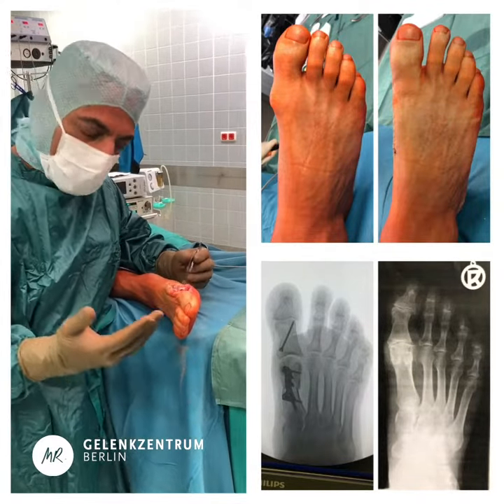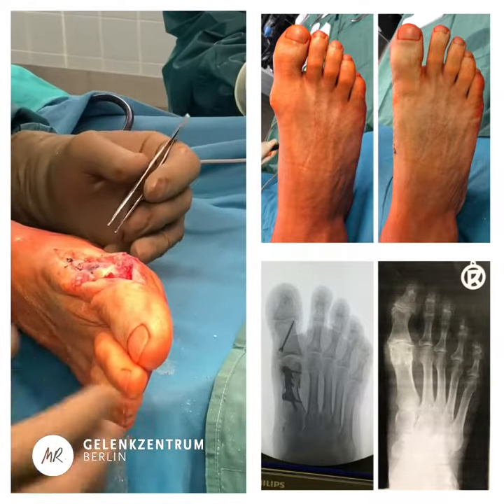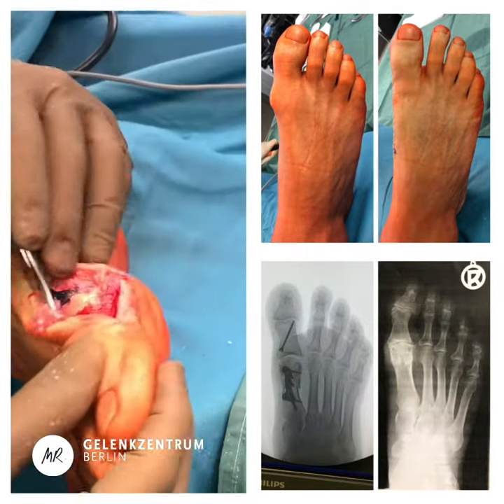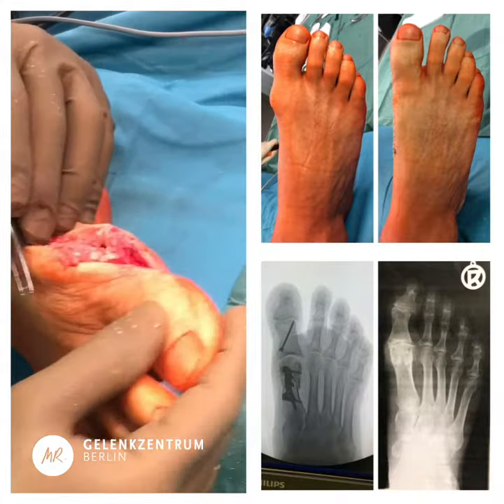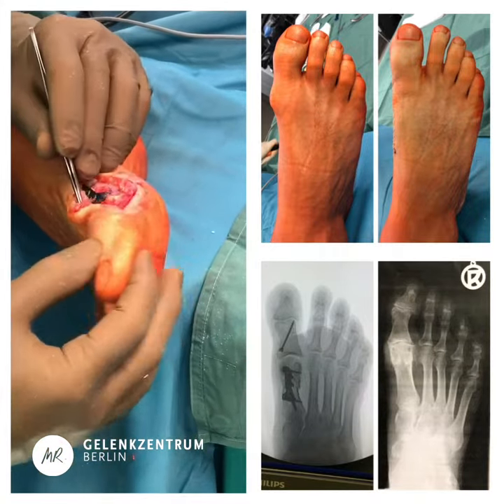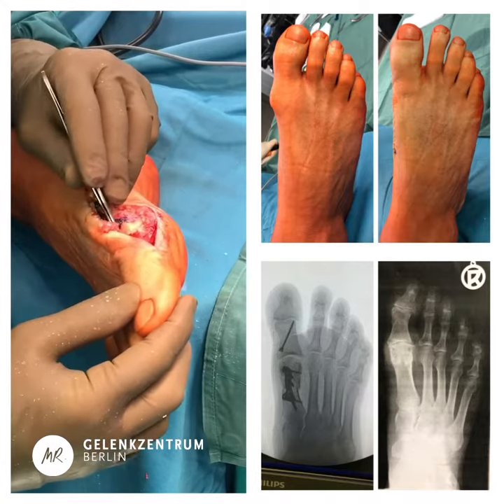We have filled the defect with a compression filling, and on the other hand you can see this wonderful range of motion that this patient is going to achieve — this is even better than normal. The osteophytes have gone.